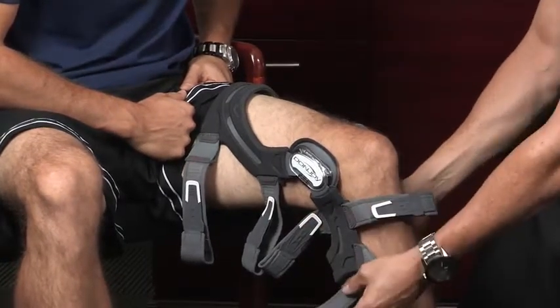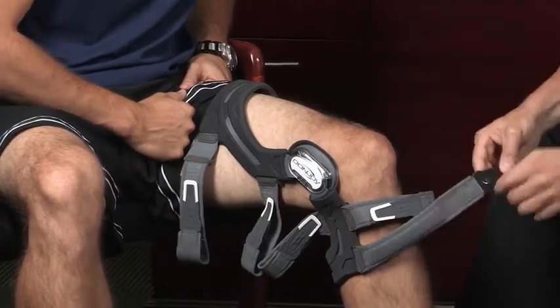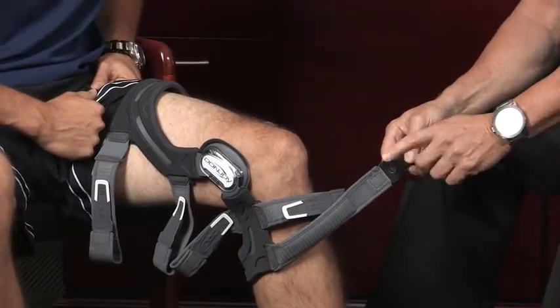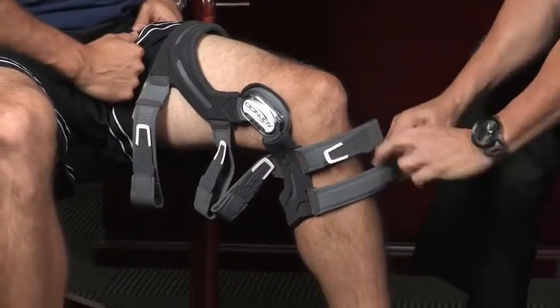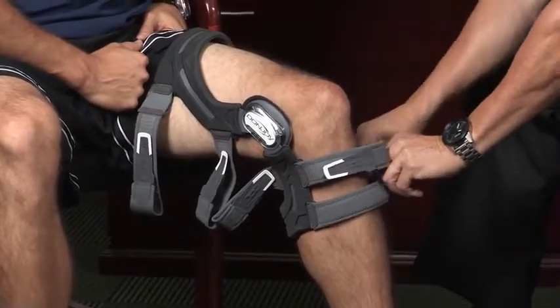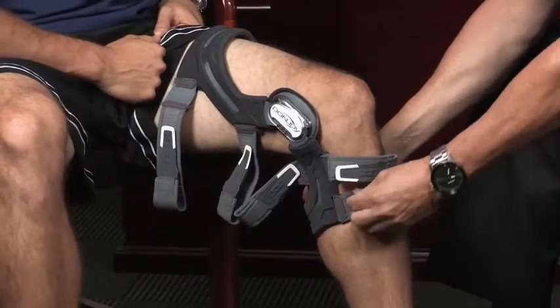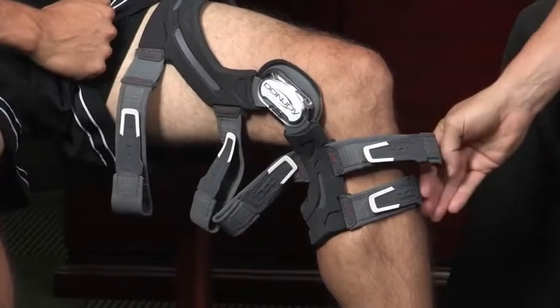We're going to go ahead and go through the strapping sequence. What you'll notice on the strap is right here there's a number. We don't expect you to memorize them, but the numbers are right here. The first strap is the lowest strap on the brace. Put it through here and pull it tight — you don't have to pull it super tight at the beginning, you just want to get it positioned. That's number one.